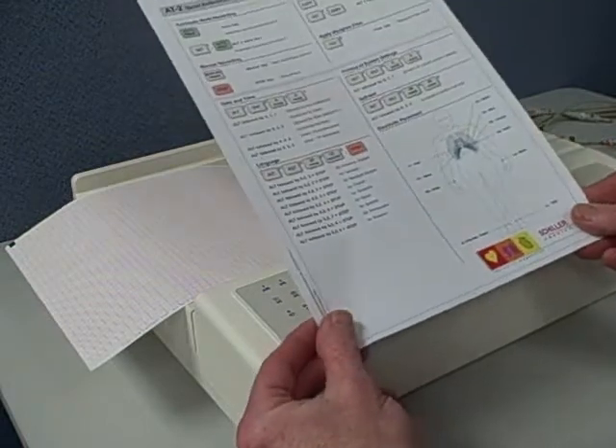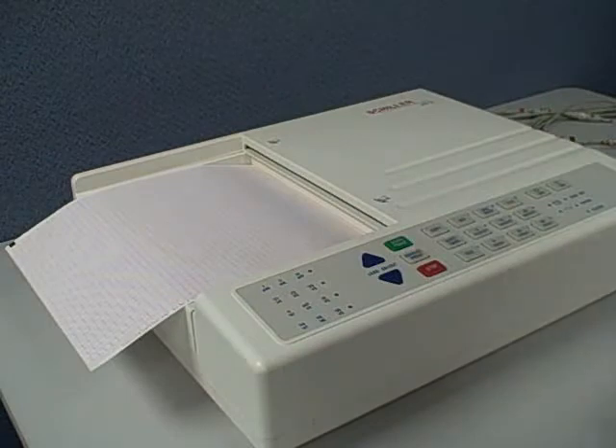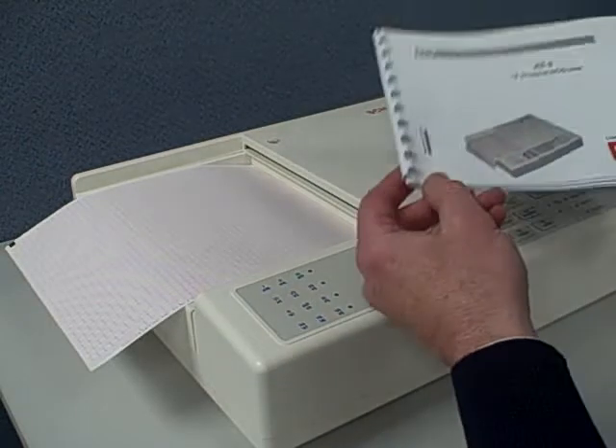The AT2 uses 8.5 by 11 z-fold thermal paper. It has a nice quick guide that comes with the machine, giving you a quick view of operation.